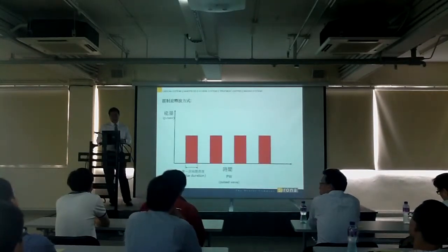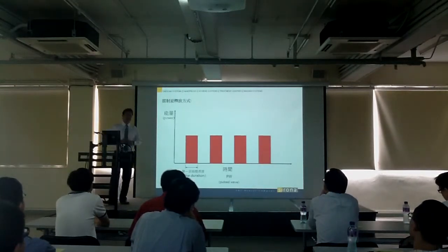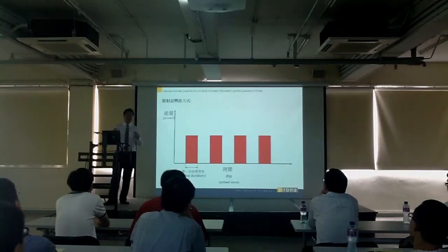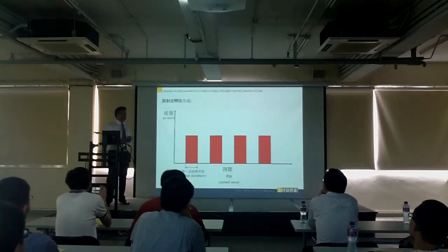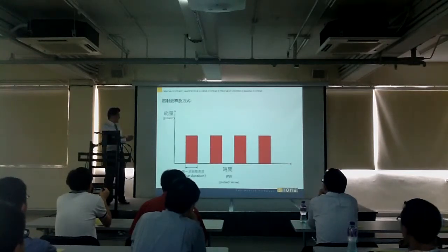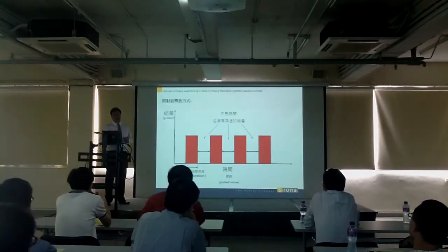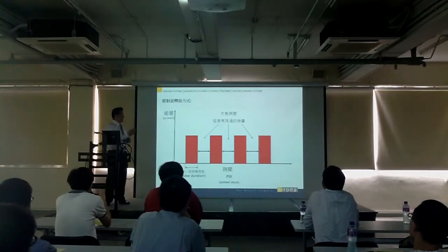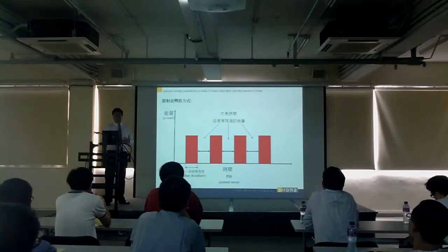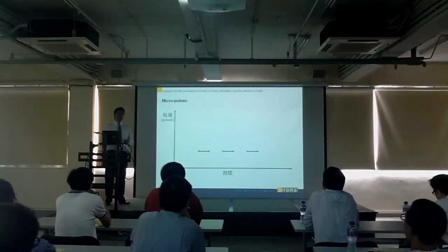Normally, laser works in pulses. Even if it tells you it's a continuous wave, CW, you will see this initial response. It still works in pulses. Why do we work in pulses? Because this time in between pulses is very critical. We need the tissue to cool down. If you don't have this, you get charred. Basically, you burn the tissue. Instead of time, sometimes we use water for cooling as well.